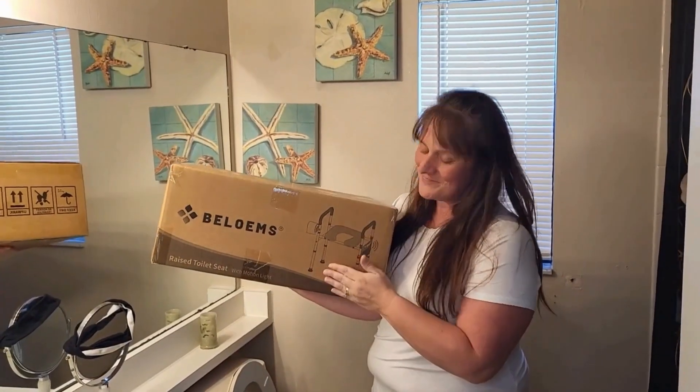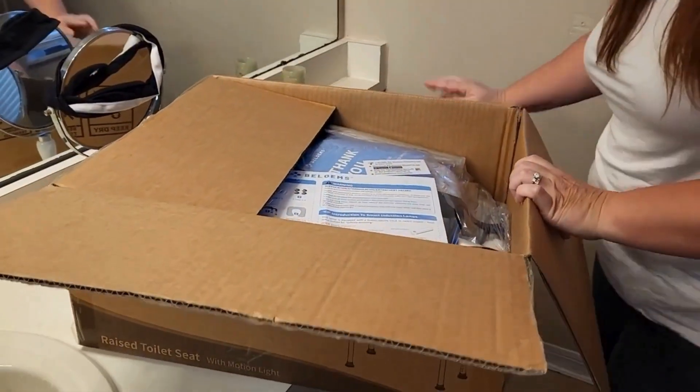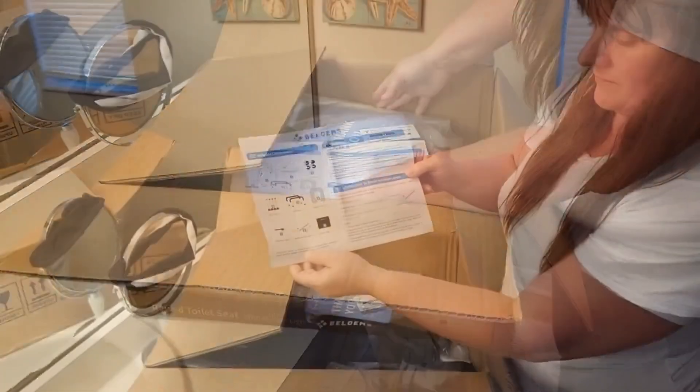Hi all, Rebecca here and today I'm doing a review on this raised toilet seat. It was gifted to me in exchange for my review.